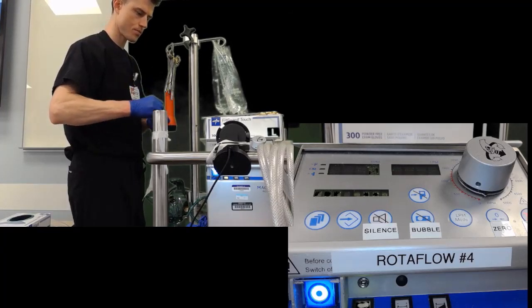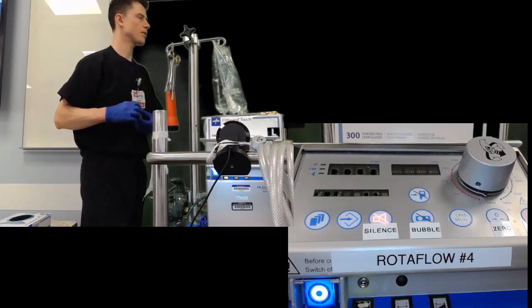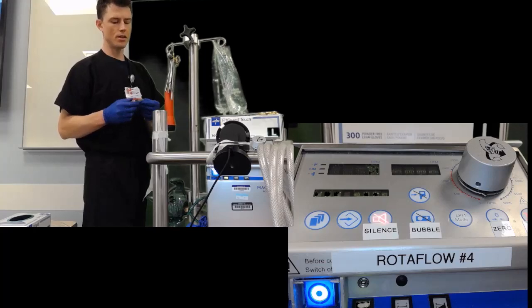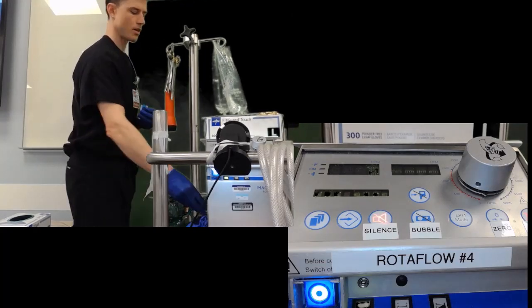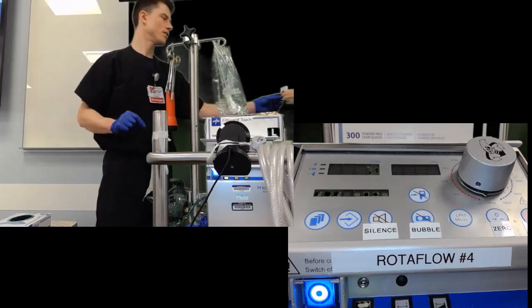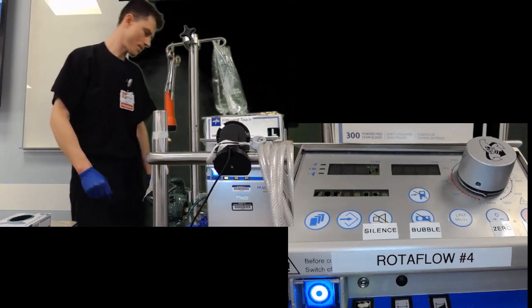Typically when you're changing this out or putting the jelly on, you put the flows all the way down first. And sometimes perfusion is a little more adventurous, and they'll just squirt it in there. You kind of rock it to the side without uncoupling it from the magnet and just shoot it in there.